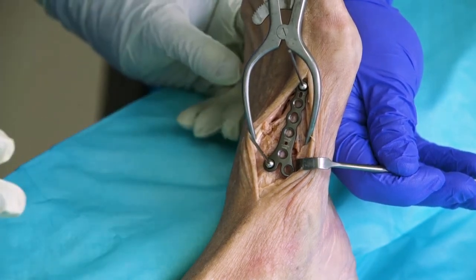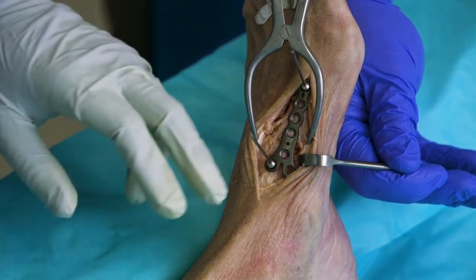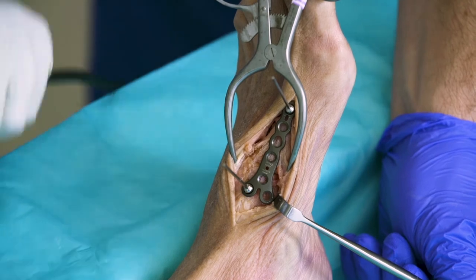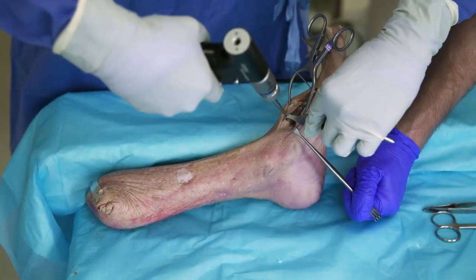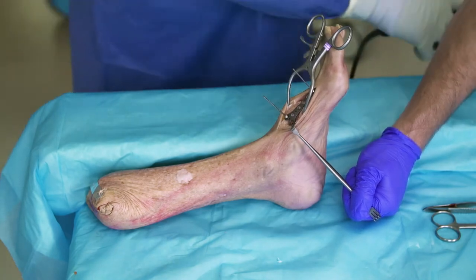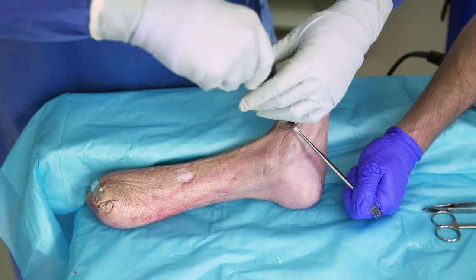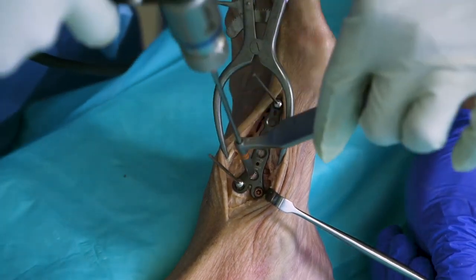Here we can get an x-ray and confirm our position of the plate. These take both 3.5 millimeter and 2.7 millimeter screws. Since this is a first metatarsal, 3.5 millimeters is a great size, and in the cuneiform 3.5 millimeters is also a good choice. For that we would use a 2.6 millimeter drill bit — in the Stryker system it's double orange to denote the appropriate drill bit and screw size. I would start with the more proximal screws, which allows us to use the compression slot later. These are variable angle locking, so they will lock in up to 15 degrees.